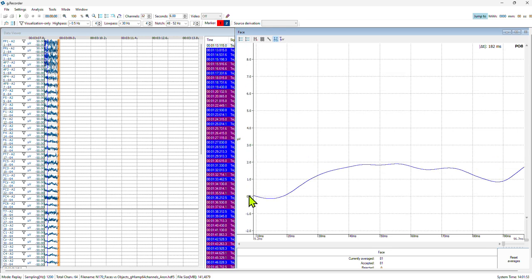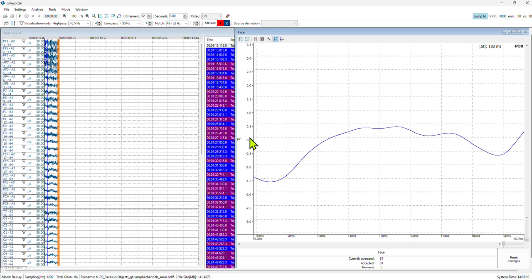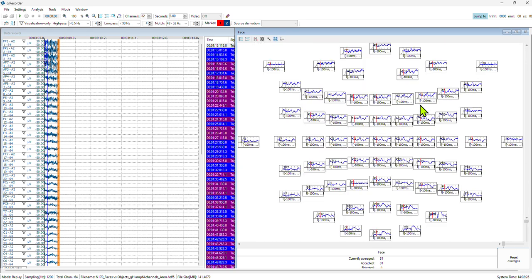So you see, now I adjust it. Now it's not very central, so if I want to see it in even better resolution, now it is kind of running away. So now you press and hold the left mouse button and move it up. And if you're looking for the 0, you put it in the middle, and now you have your curve. Coming again on the x-axis, double left click, and voila, here it goes. So this is the zoom mode for the single channels, which you obtain by double clicking on that channel. Maybe I didn't say that.